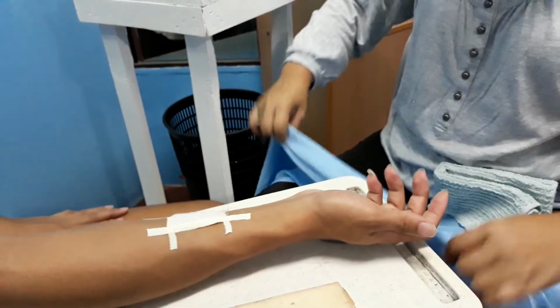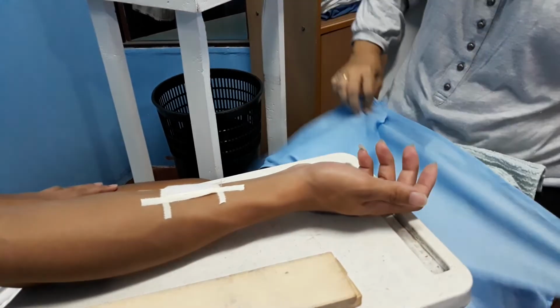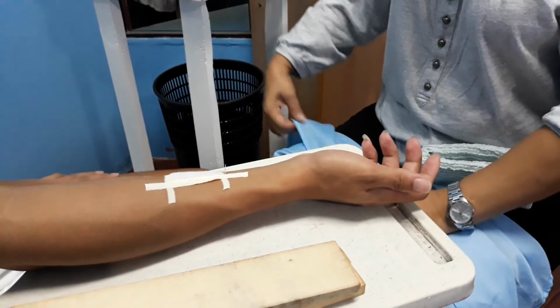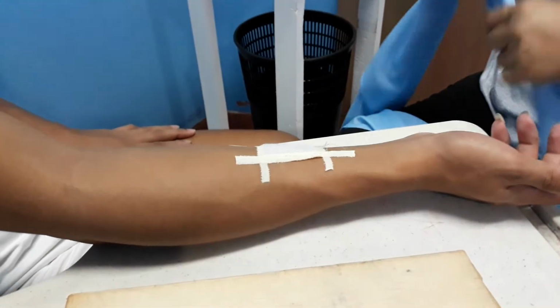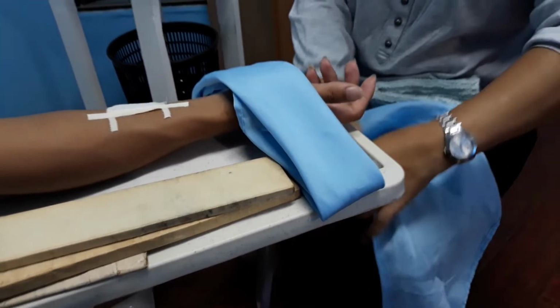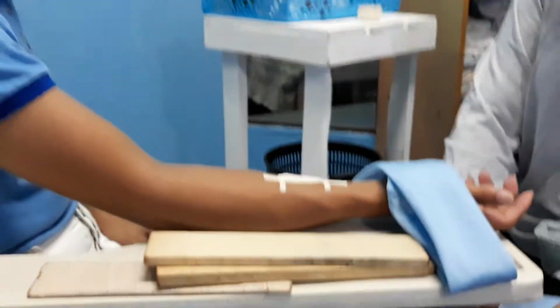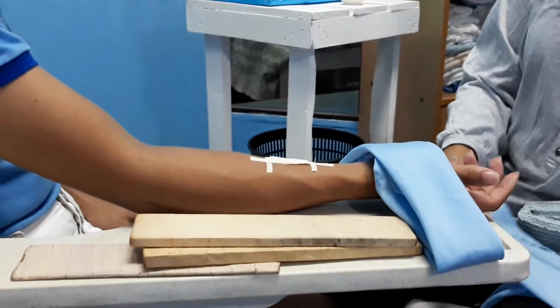This is an example of your bandage. This bandage is a little bit small compared to the normal size of your bandage, as discussed during your emergency management module. But for the sake of this demonstration, we have to utilize this small type of bandage for your convenience in presenting the topic discussed, your wound dressing.